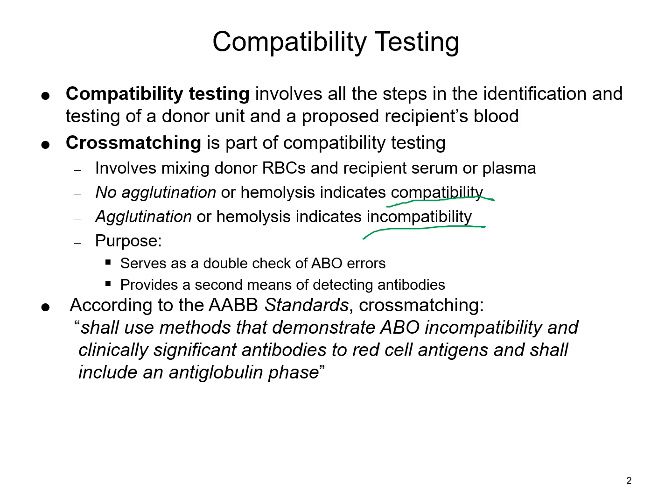And it also provides a second means of being able to detect any kind of antibody that you may not have detected while you were doing the pre-testing, that type and screen, that antibody screen. So just in case you missed anything there, this should be that extra check to determine if you've missed anything or made any errors.